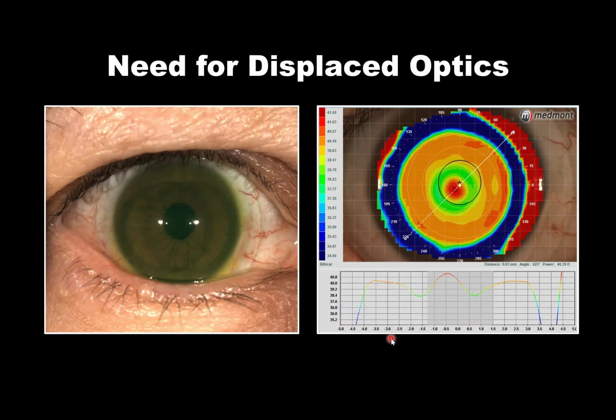Si vemos que el lente está descentrado y la óptica está descentrada y tenemos un mapa como este que nos indica, mira, sí, está descentrado, como pueden ver en la gráfica, pues podemos quizás corregir esa descentración. La pregunta es, ¿cuánto vamos a corregir? ¿Cuánta descentración existe y cuánto tengo que corregir?